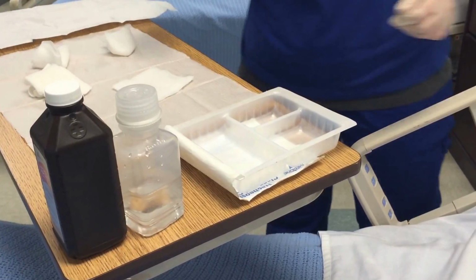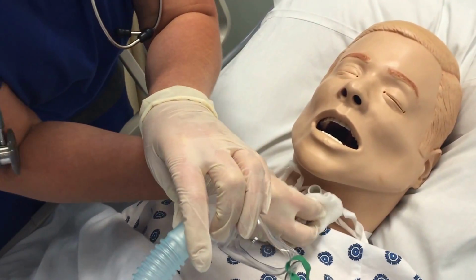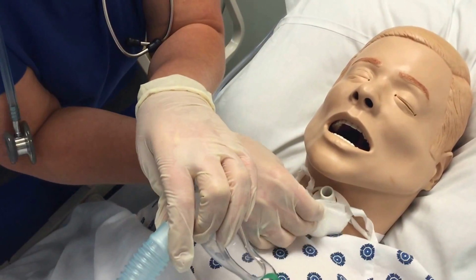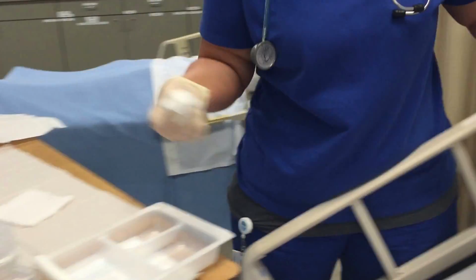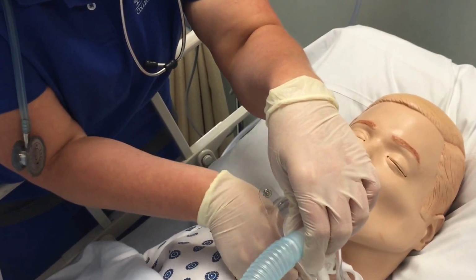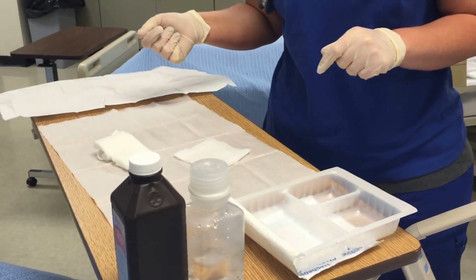So now I'm going to take the one that I just dipped in the peroxide and saline and clean around the stoma faceplate. You want to actually go around the stoma and faceplate, not just the faceplate, because that's two different things, not just one. And then that can be pitched. Then we're going to grab the one that we dipped in the saline and go around the same thing. There we go. And then that's going to be pitched.